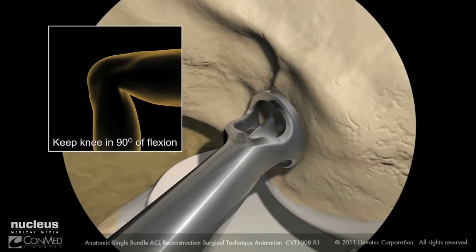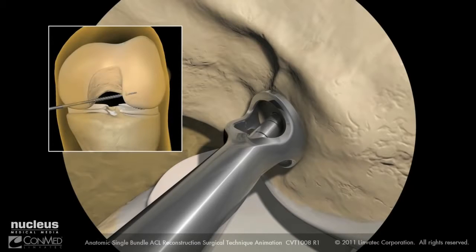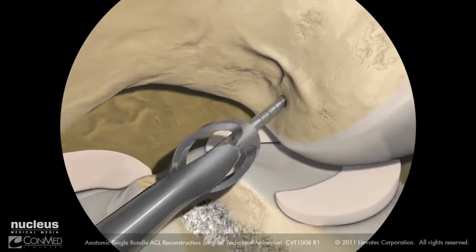Back the guide pin out to check that the guide pin correlates to the mark you made earlier in the center of the footprint. Using the guide to position the guide pin, hyperflex and elevate the knee. Advance the guide pin to the lateral femoral cortex, noting the aperture to cortex depth, then advance out of the skin. Continue advancing the guide pin out through the skin laterally, using a twisting motion to remove the femoral footprint guide.